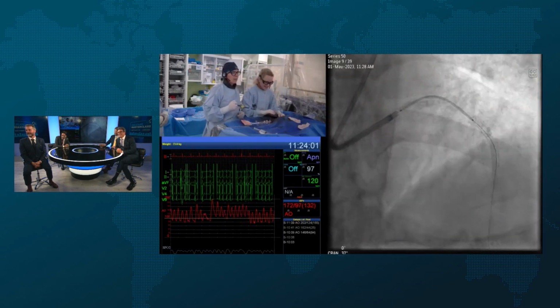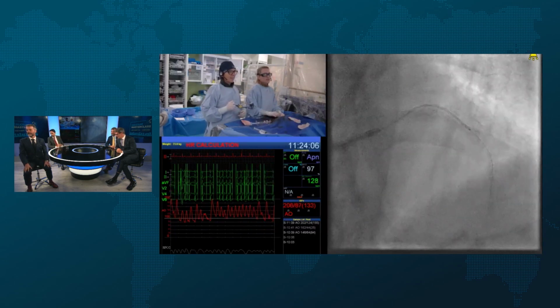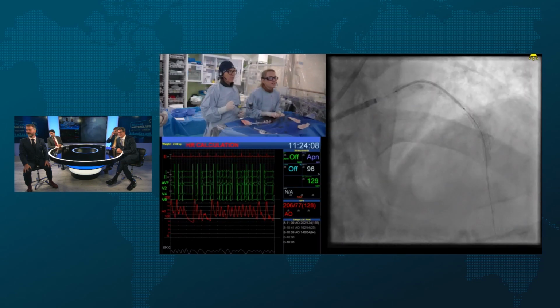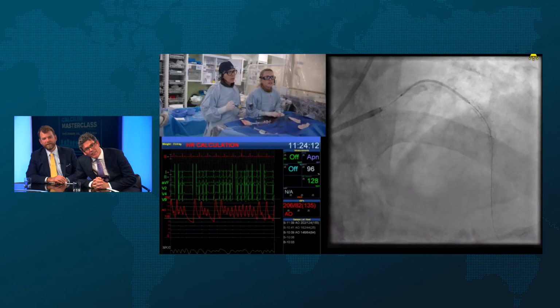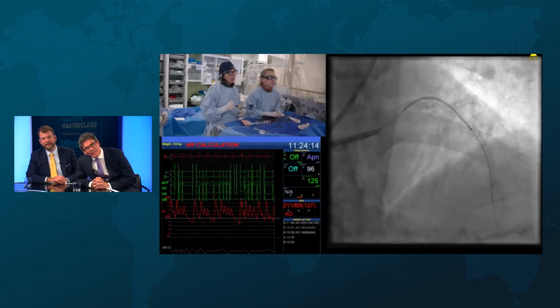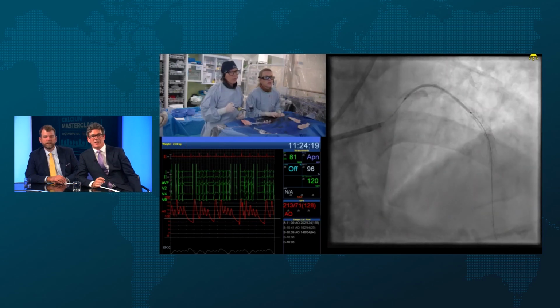Just one touch. Looks like you're short distally. Yes, there you go. Maybe it's okay. You might not be able to see the stent boost. Oh, do you have the boost? Oh, yeah, we can see the boost. Lovely. If you go to the bottom, there we go. That's good. That's nice.